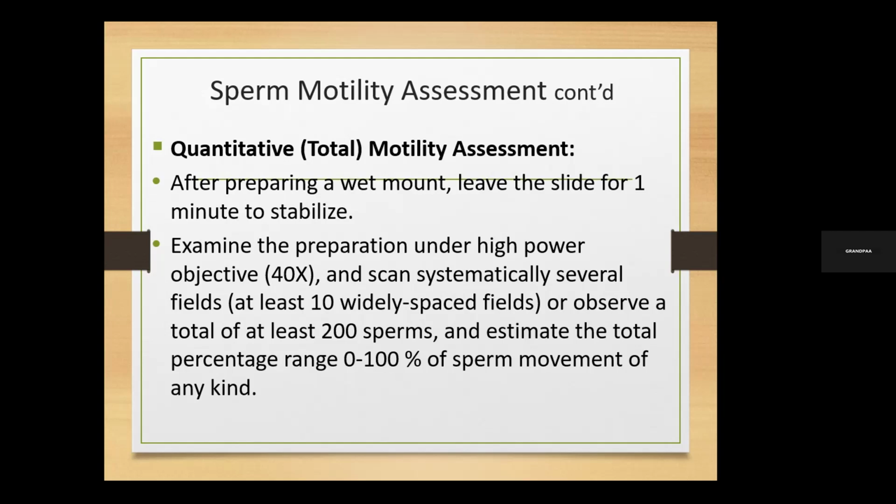With total motility, you are not considering whether it is moving fast or slow or upward, for as long as there's movement. In that case, you can look at the percentage of sperm that are dead, in quotes, because you are going to do the vitality test. There might be a cell lying down, not moving, not doing anything.